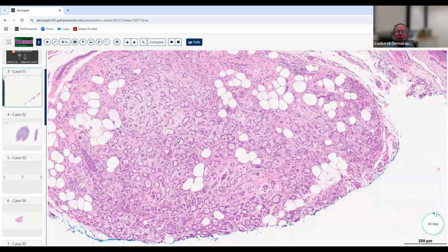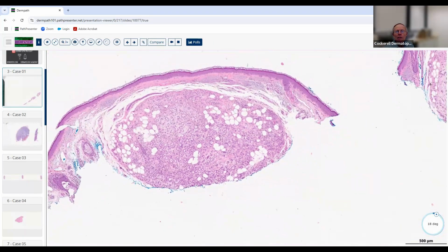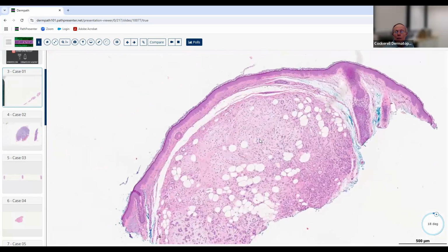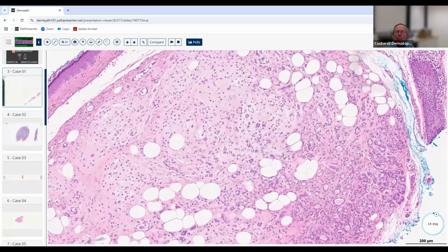So benign lesion, eccrine differentiation, and it's got this nice example of what we would call a mixed tumor, with the mixed component being the mucinous stromal component and then the epithelial component. That's why it's called a mixed tumor. The only couple other teaching points about this is that this obviously didn't occur on a mucous membrane site. We're looking at sun-damaged skin, so it's not in somebody's mouth or anything like that. But if you get the same exact lesion in the mucous membrane, most commonly the mouth, it's basically called a pleomorphic adenoma, and that's the same exact morphology, occurring as a sort of differentiation toward the minor salivary gland. And so in the oral cavity, it's known as a pleomorphic adenoma. We still could call it a mixed tumor, but if it occurs in the glabrous skin, we call it a mixed tumor or chondroid syringoma.